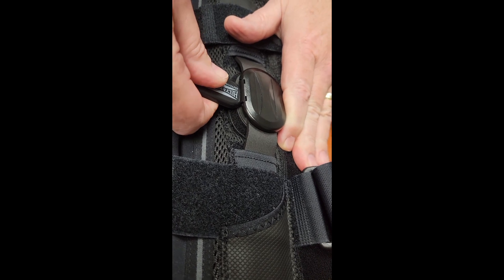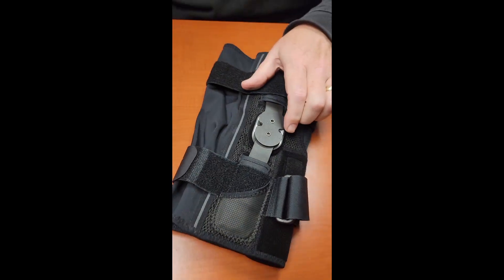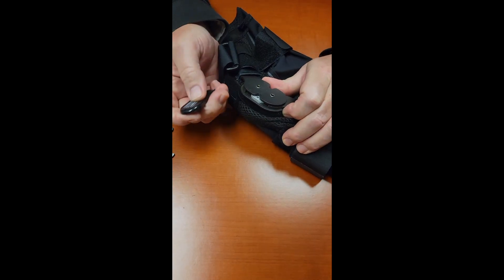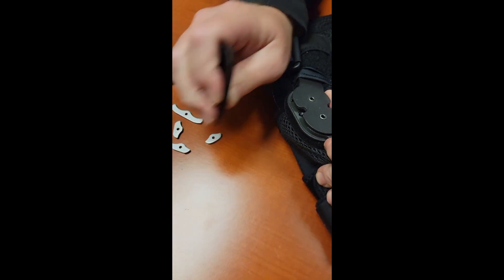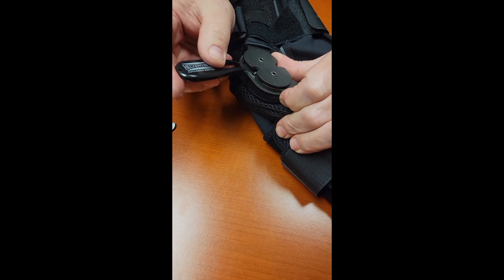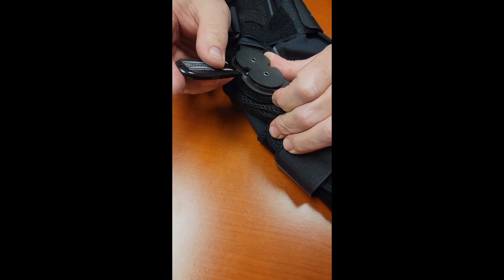Turn it and the cap comes right off. To adjust any of the extension stops, flex the hinge, put your tine of the tool into the hole, and just pull that stop out. The brace is now ready to receive a zero degree, 10 degree, 20, 30, 40, and up to 50 degree extension stop.